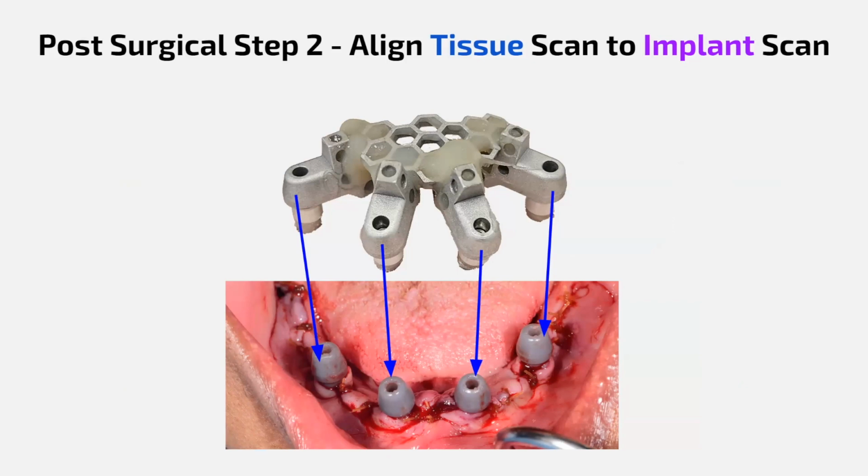And so you could see here, this is how we aligned the tissues to the implant, right? The posterior portion of the OPTISPLINT is actually very identical to the design of these tissue scan caps. So those really align very nicely and very easily. And of course, a lot of times the alignment's going to look like they don't match very well, but you always trust the implant record over the tissue scan so that you can capture the implant positions in the best possible space.